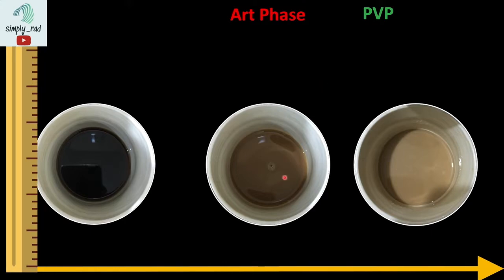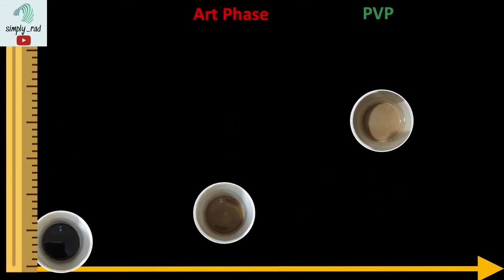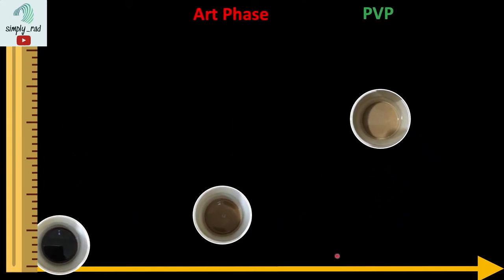If we arrange the degree of hepatic enhancement in these phases, we will see something like this. Of course, the peak enhancement occurs during the portal venous phase.